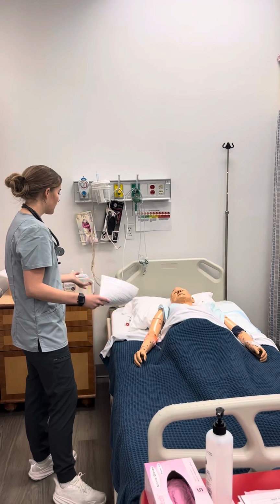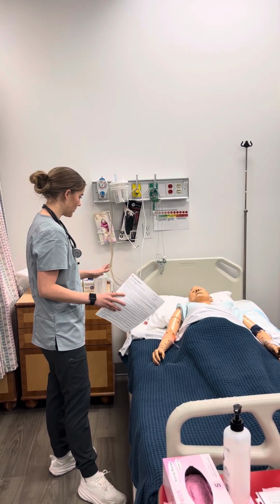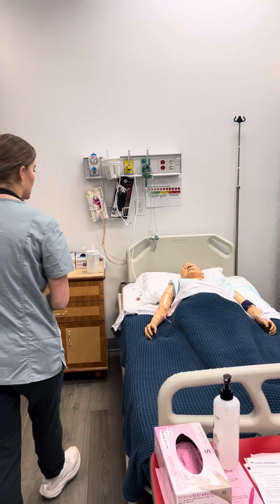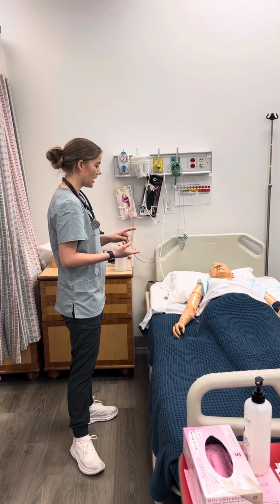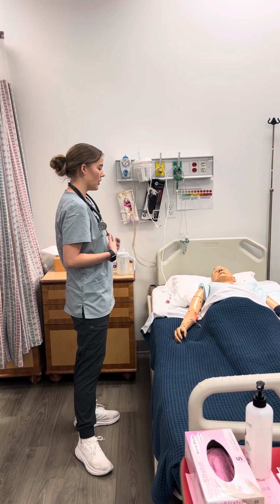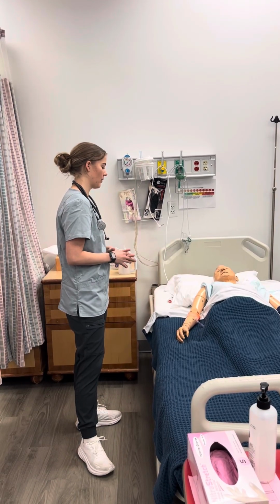So the doctor's ordered the blood transfusion. You already know about that. You did sign this. Are you still okay going forward? Okay, great. I'm gonna set that aside for just a minute. So just some side effects of this transfusion can be itching, hives, swelling, shortness of breath, fever. If you experience any of these, please let me know. If you experience anything unusual at all, just please let me know, okay?